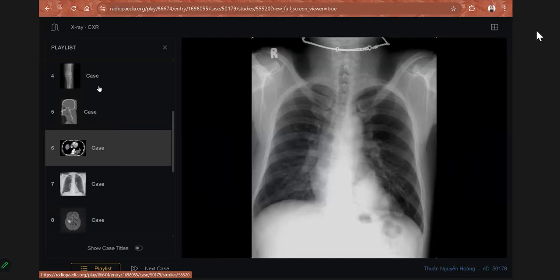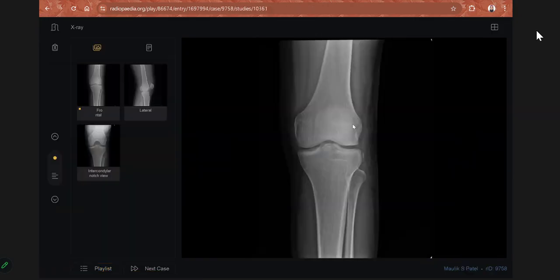So this was your first case. Yes, sir. Very nice. You picked the pathology in 33 seconds. Oh, very good. For the second case, you picked the fracture, the curvilinear radio density just parallel to the lateral tibial plateau, an indirect sign of ACL injury, good, and no associated osseous injury.